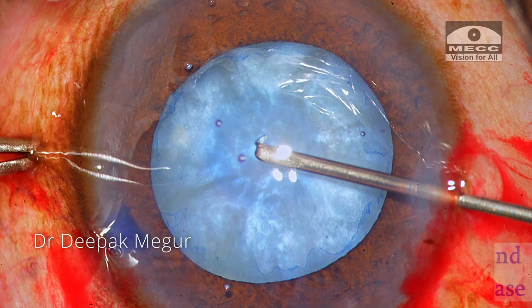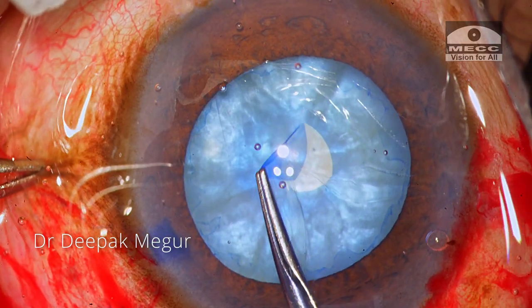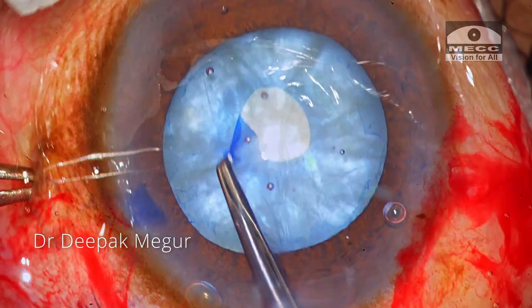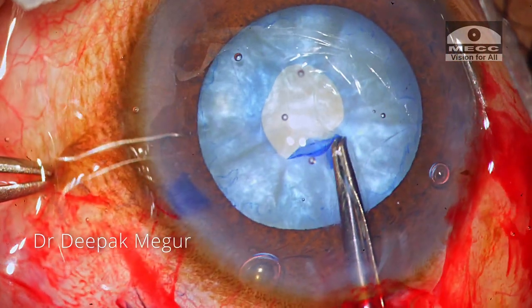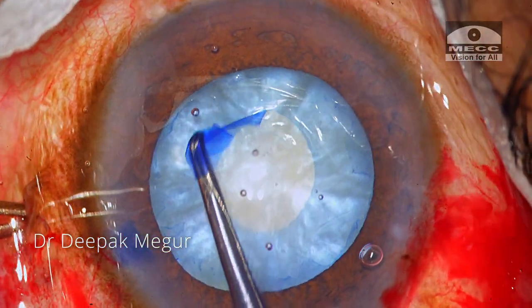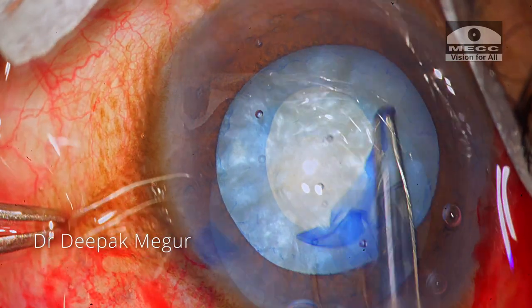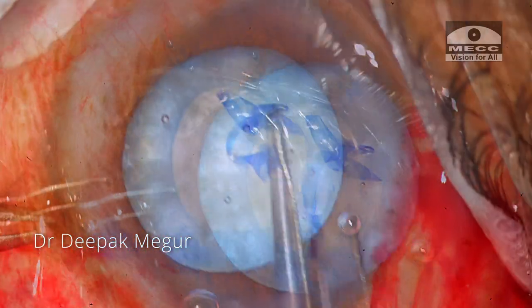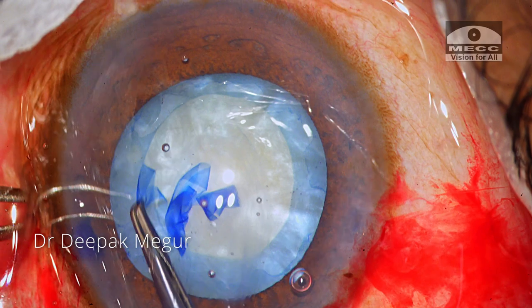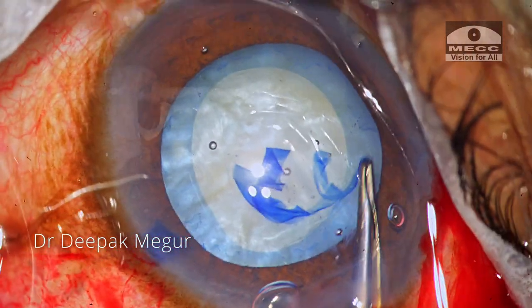The next case. There is some spontaneous decompression happening — look at this aggressive liquefied cortex. The initial part of the small rhexis is created using the tearing technique; the flap is held flat and pulled centripetally. In most instances, this is the stage at which the rhexis runs off towards the equator, so we need to be careful. As soon as I near the end of the circle, I hold the flap and instead of joining the circle, I tear around it. Using this thin flap of the capsule, the rhexis is now being enlarged — this is called the spiral or the whirling mode. I may have to do a couple of circles to achieve the desired size. What is striking is the amount of control we have; the small flap allows us to make the capsule behave well.